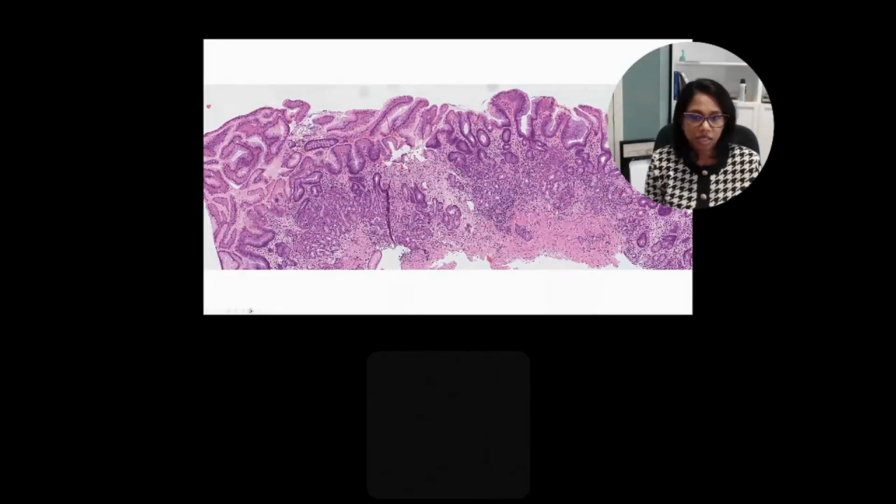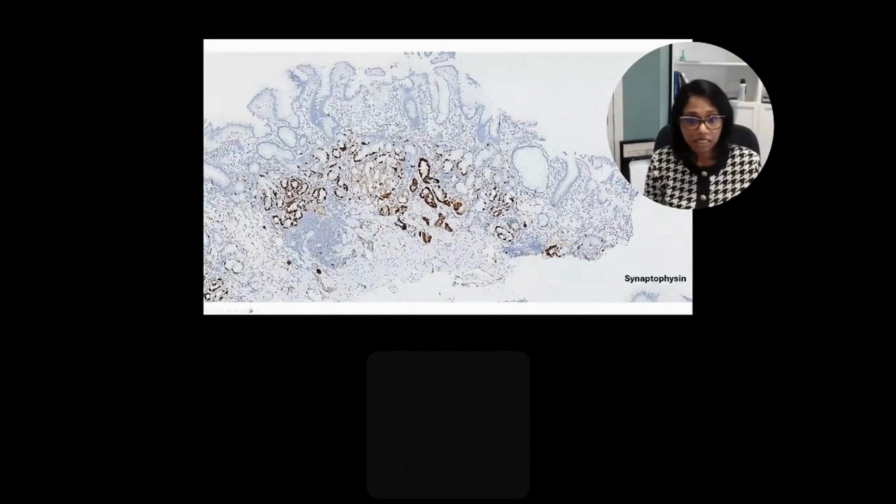Also nice to do are neuroendocrine stains, because you'd like to comment on the presence of ECL cell hyperplasia. It can be linear, and it's usually a collection of more than 4 to 5 cells in a linear fashion, continuously staining for neuroendocrine markers. And over here, you have some early micronodular or nodular ECL cell hyperplasia, which effectively is the precursor to neuroendocrine tumors. I often like the neuroendocrine markers because these little nubbins of nodular neuroendocrine cells may not be readily visible, and you might miss a very subtle neuroendocrine tumor.